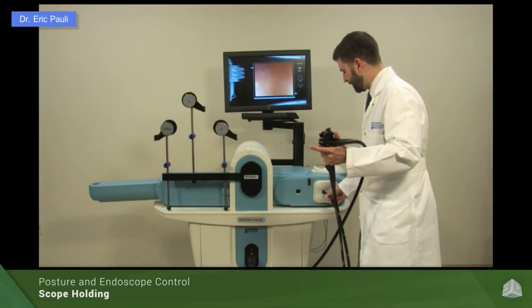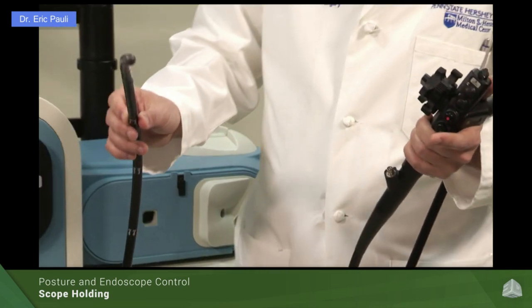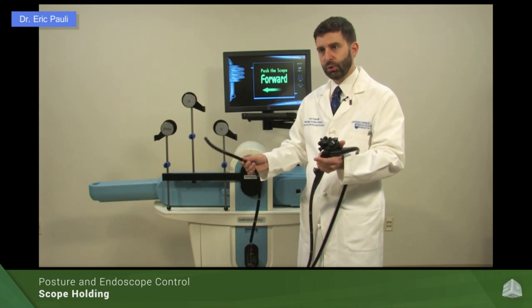That lets me have my right hand to hold the distal portion of the insertion tube, which allows me to do some of the motions we're going to show you in a minute, including advancement and retraction of the scope, as well as to provide some of the torque maneuvers.